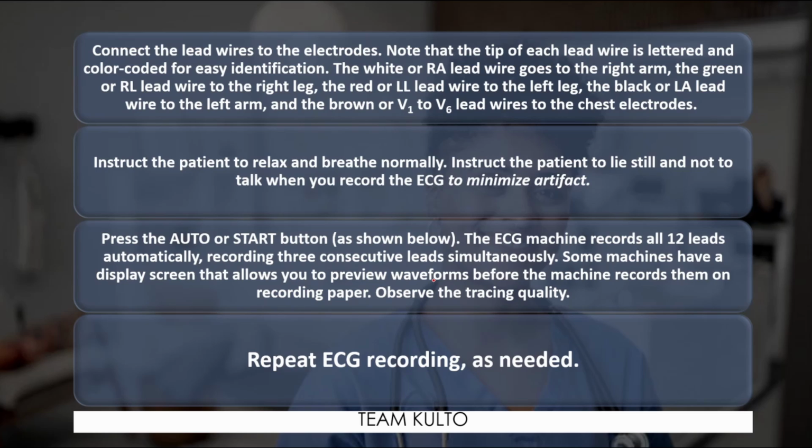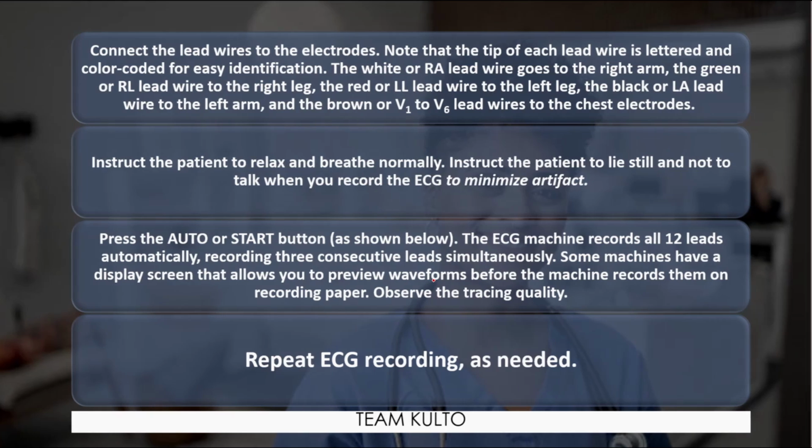Normally sa ospital sa ginagawa ko, I run the ECG twice. Just in case para may magkaroon ng, alam mo yon, yung reserba, or kapag pangit yung kuha sa umpisa, ulitin ko siya sa pangalawa. 2 or 3 ECG readings kapag gano'n ang practice ko.